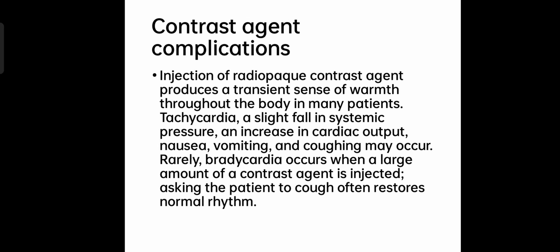Contrast agent complications. Injection of radiopaque contrast agent produces a transient sense of warmth throughout the body in many patients. Tachycardia, a slight fall in systemic pressure, an increase in cardiac output, nausea, vomiting, and coughing may occur. Rarely, bradycardia occurs when a large amount of contrast agent is injected. Asking the patient to cough often restores normal rhythm.